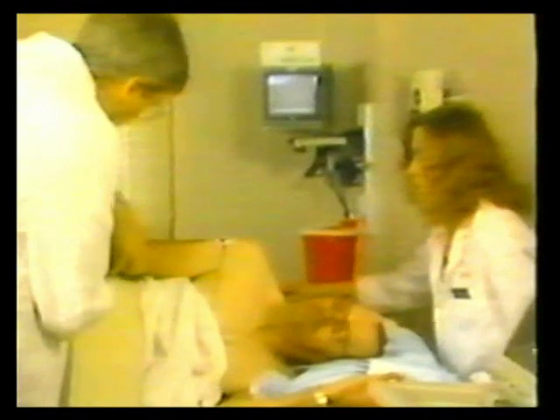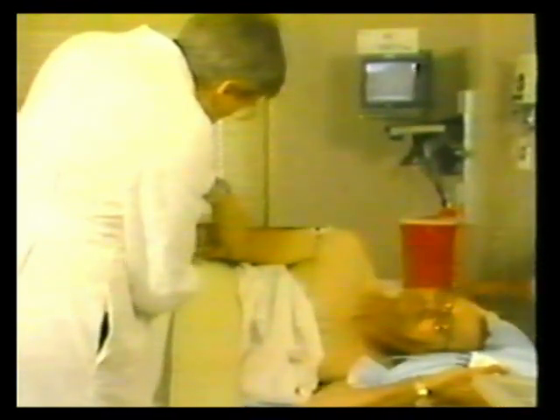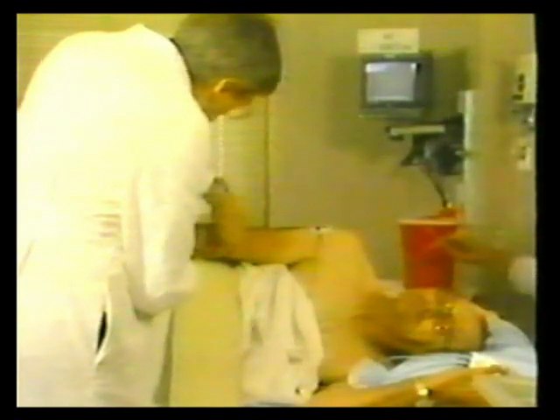Local pharyngeal anesthetic is administered in the form of an aerosol. Usually 1 or 2 applications are necessary. The patient is instructed to roll the anesthetic in the throat and then swallow. If drying or sedation is utilized, it is given through an indwelling antecubital venous entry site.